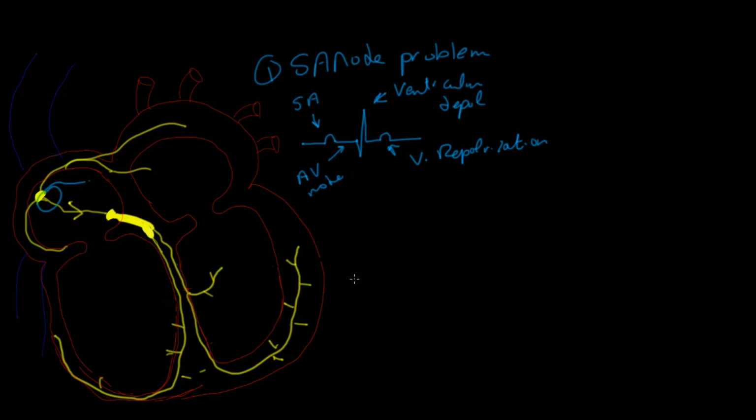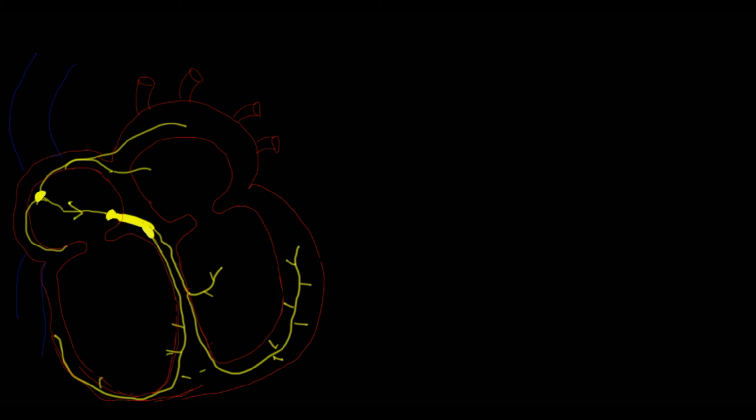If you look at the ECG below, this is again a P wave, QRS complex, T wave, another P wave, QRS complex, T wave, P wave, and then nothing. So the trouble that happens in the SA node can be in the form of sinus pause. We'll speak about each of these troubles in more detail and how the pacemaker helps to fix them. But now I'm just giving examples of what the possible outcomes are if something happens along the conduction system.